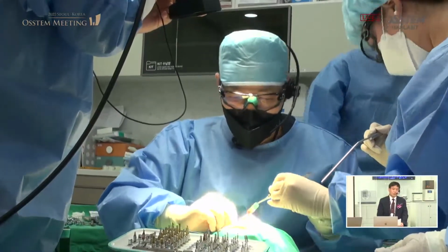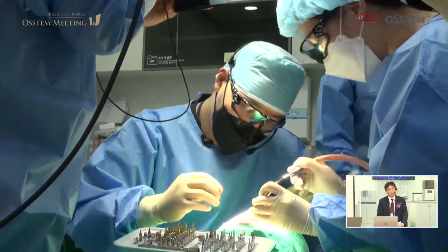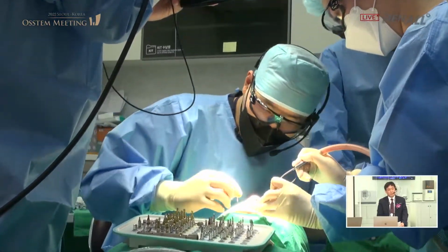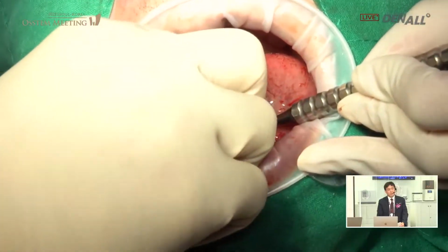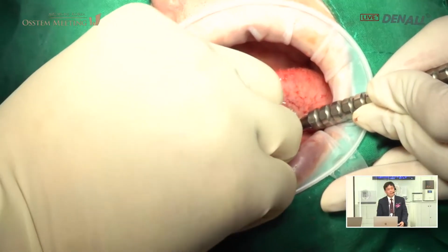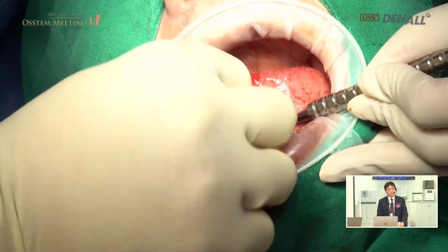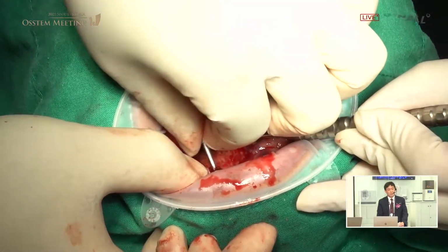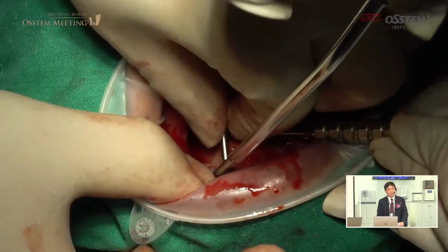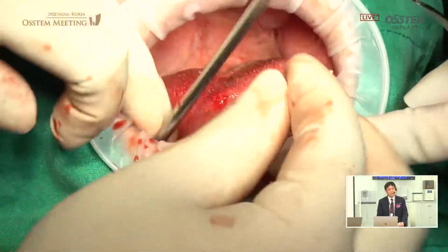The angled abutment is connected. Suction, please. Please move this away.